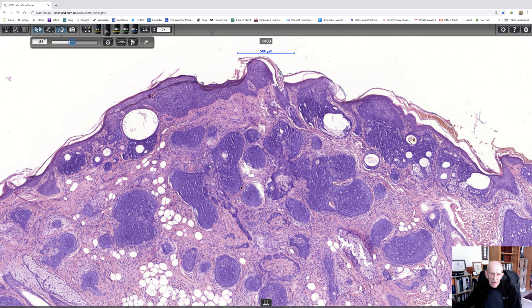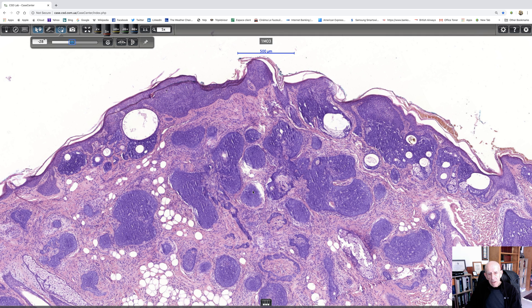That bit there looks awfully like a trichoepithelioma, so that would be another differential. I tend to distinguish between trichoepithelioma and trichoblastoma, particularly because trichoblastoma is non-syndromic. It doesn't really matter very much to the patient — it's just a nodule which usually presents on the scalp, slowly growing, it can get quite big, and that's about all there is to it. Very exceptionally, trichoblastoma is malignant, but those are really as rare as hen's teeth.